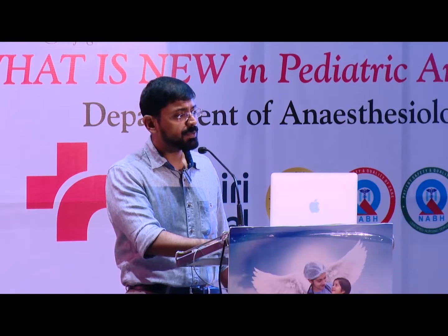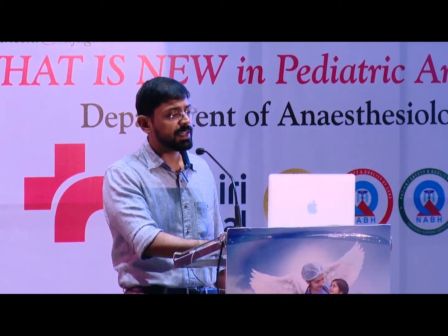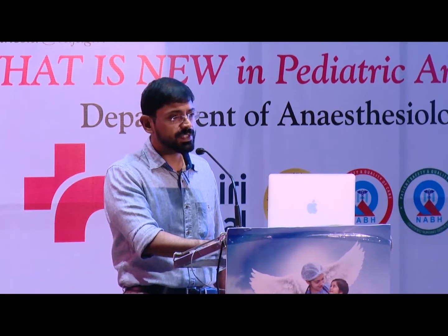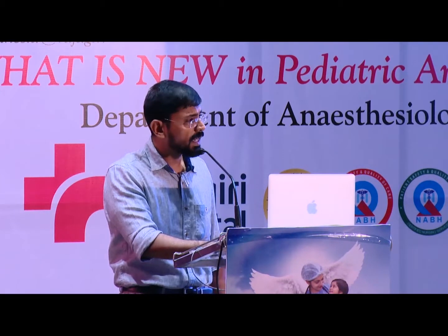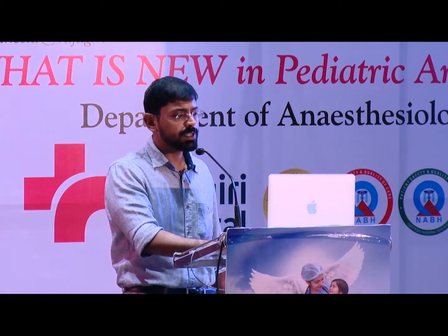So after high frequency ventilation on settings of 11 Hz, delta P of 18, MAP of 11 and FiO2 of 30%, the gas is still fine. We managed to bring down the MAP to 9 and frequency is brought to 12 Hz. So the decision is when do we put him back on SIMV. At fairly minimal settings, frequency of 12 Hz, if we have a delta P less than 20 and a MAP less than 10, we can very well put him back on SIMV, which is what we do.